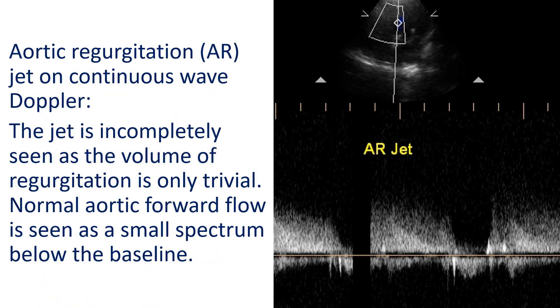Aortic regurgitation jet on continuous wave Doppler. The jet is incompletely seen as the volume of regurgitation is only trivial. Normal aortic forward flow is seen as a small spectrum below the baseline. Continuous wave interrogation is used because the velocity of an aortic regurgitation jet is much above the Nyquist limit of the pulsed Doppler system. Continuous wave Doppler can evaluate high velocity jets but cannot localize the exact site of the jet along the axis.